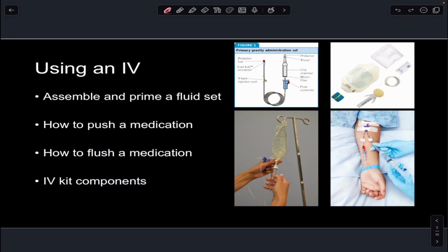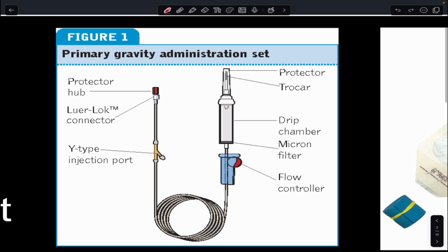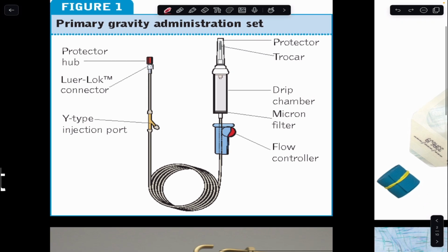So when you're assembling and priming a fluid set, there's two essential components. One is your fluid bag, and then the second is your tubing. So we'll go through just your tubing. You would receive this from somewhere around the nurse's station. You'd open your bag and you would have something looking like this. At the top, you have a trocar. Then you just have a cap that protects the trocar.